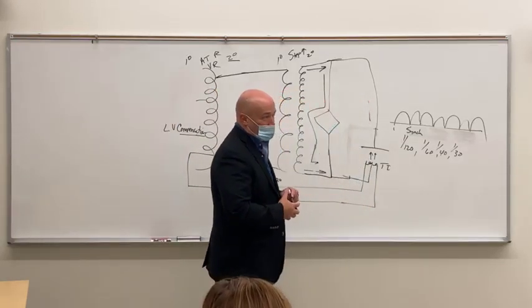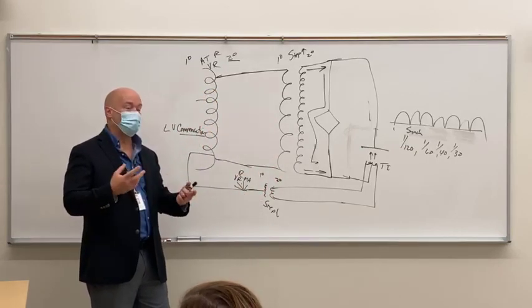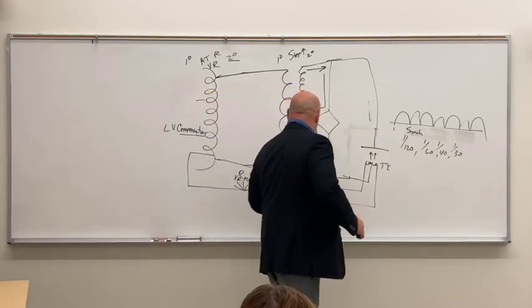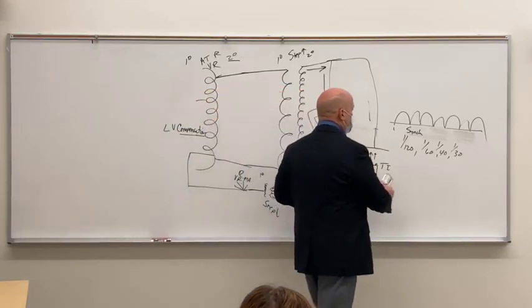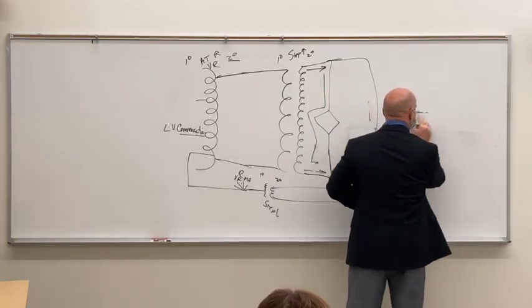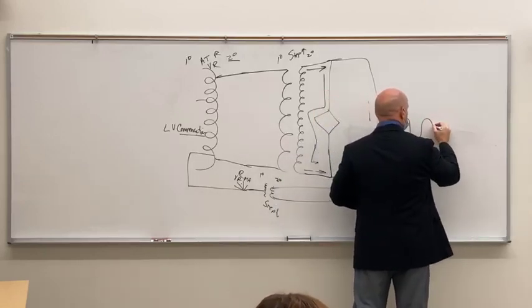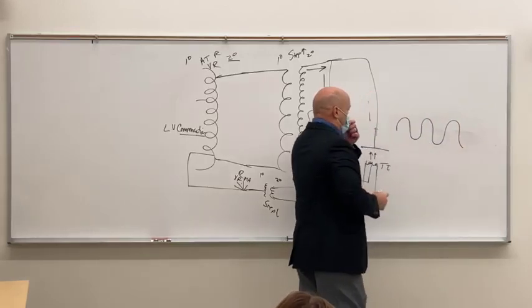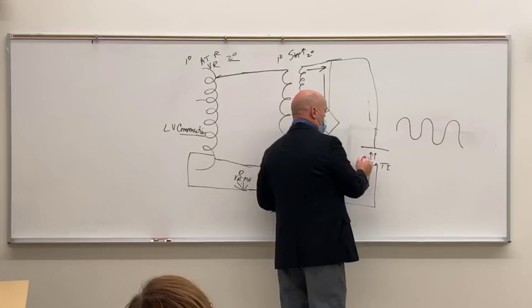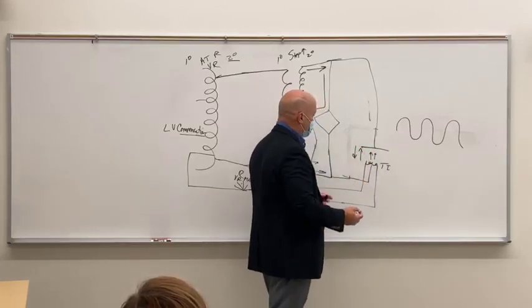All right. So any questions on all that before we go into generator type? So we've essentially got 3 generator types, and 2 of them kind of have subtypes, so to speak. All right. So if we take and we get our voltage waveform, we've got unrectified voltage, like that. So what theoretically could happen is we'll have alternating current going through our tube, and we talked about this on Wednesday.